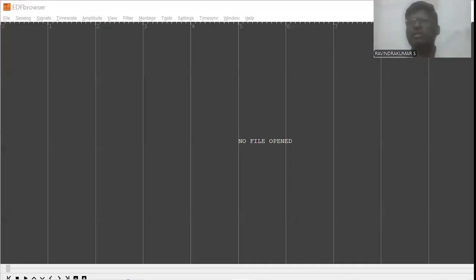When these signals are obtained from the equipment in the hospital, they come in different standards and different formats. Some files will be in .dat format, and images will normally be in .jpeg format or .dicom format. DICOM is a format used for image processing. Similarly, for physiological signals, the most used formats are the .dat and EDF databases.